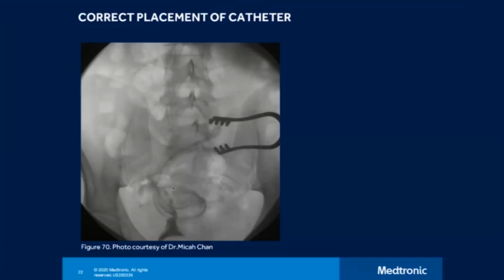I mean, it's very easy. And some people just have a lot of scar tissue. It can take a little time, but that's exactly how you take the catheters out. And we take catheters out that were placed years ago by surgeons, etc. Don't have an issue. You just really need to find that cuff and dissect the tissue around that cuff. So it can be a little bit more tedious, and that's the word, tedious, than hemodialysis catheter removal. That is very superficial. You know exactly where the cuff is, but the fibrous tissue that you dissect is very similar to the peritoneal fibrous tissue.